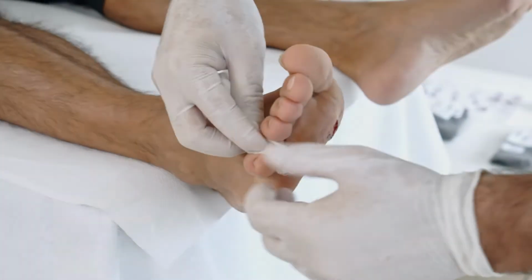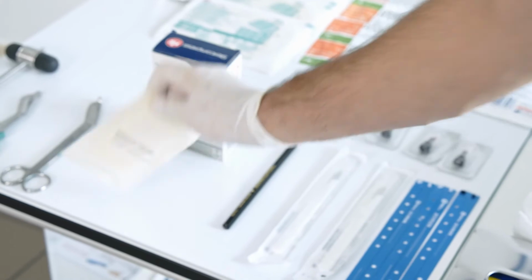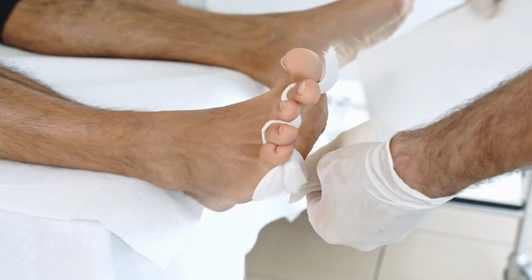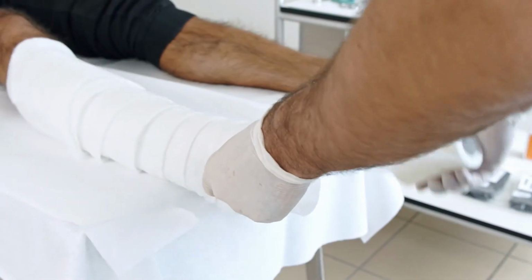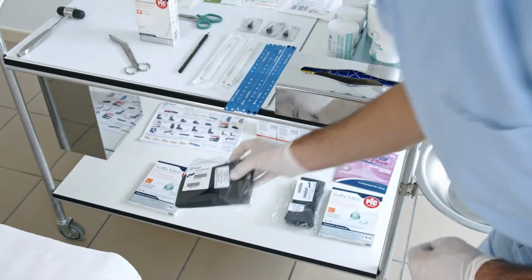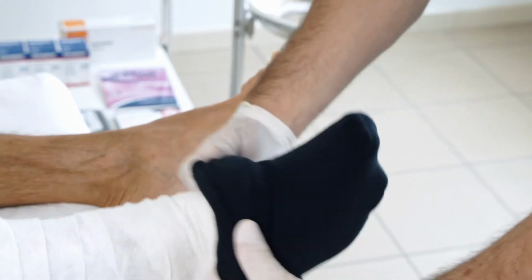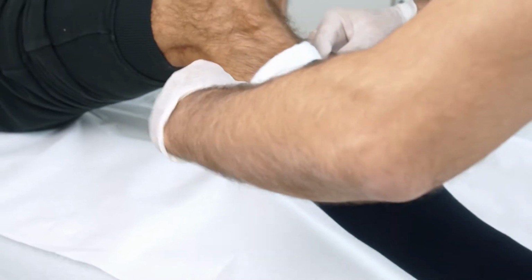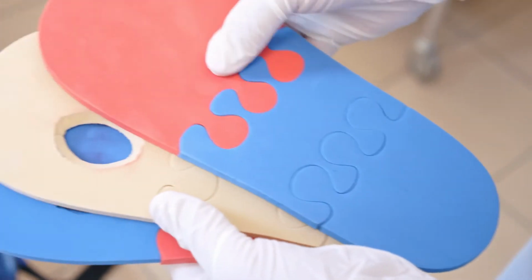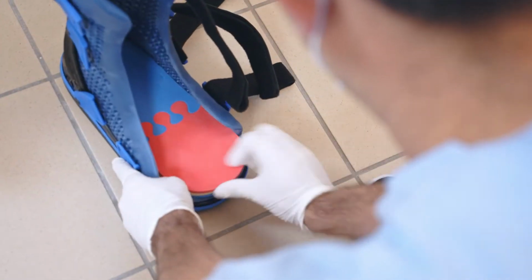We first dress the patient's foot by protecting the interdigital space with a cotton gauze, then apply a bandage with a cotton roll and cohesive bandage from the base of the toes to 2 cm to the popliteal area. An extensible, seamless cotton sock is supplied with SBI products to protect the dressing by limiting tension on the skin as much as possible.